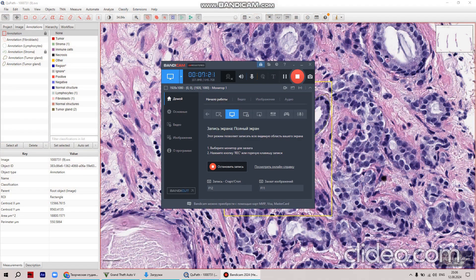Always pay attention not to overlap different annotations with each other. Please try to have spaces between annotation lines. When you complete the stroma, if you want to draw different cell types, lock the stroma annotation. Then draw different cell types like fibroblasts and lymphocytes.